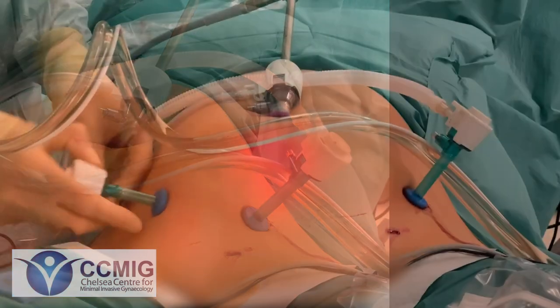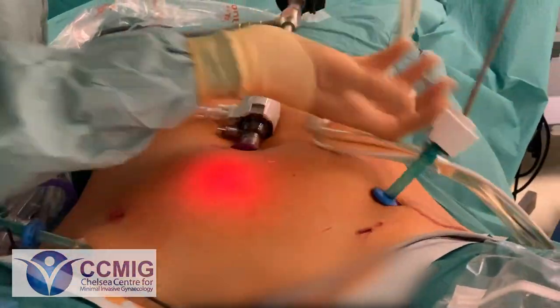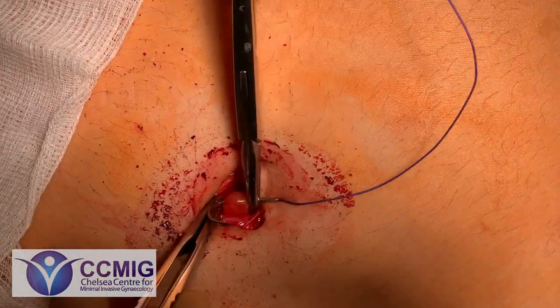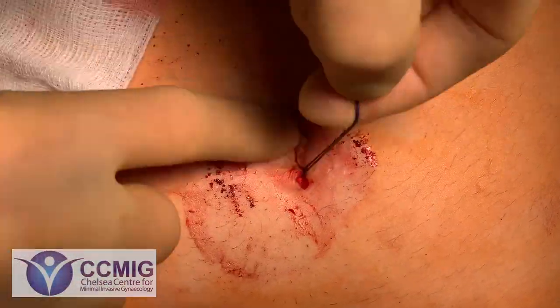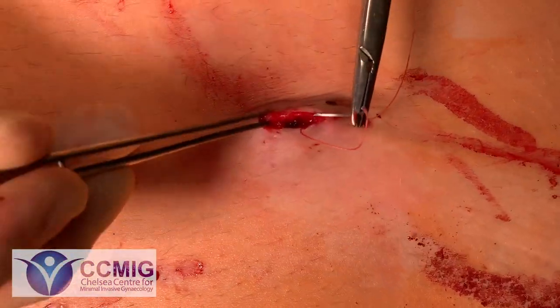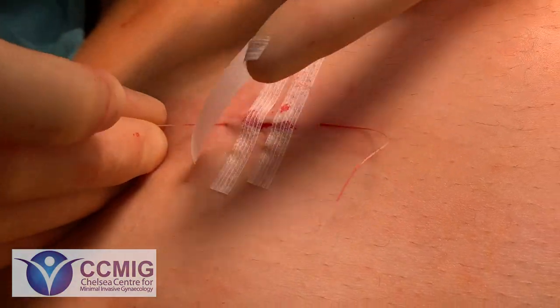Here the balloons are being released to allow the ports to be removed, and then one by one the ports carefully come out, releasing that last bit of gas. This is us closing the umbilicus or tummy button. There's a layer deep to the skin which holds everything together — if we didn't close this layer there's a small risk of having a hernia after the operation. Then we use a reabsorbable stitch to close the skin; this stitch goes just underneath the surface so usually people don't see any knots. Stitches don't need to be removed. A couple of steri-strips just to hold everything carefully in place, then a last dressing, we trim the ends of the stitch and then we're all finished.